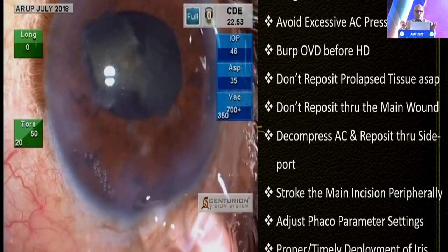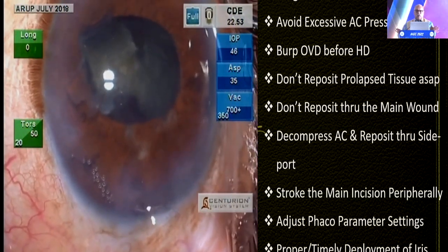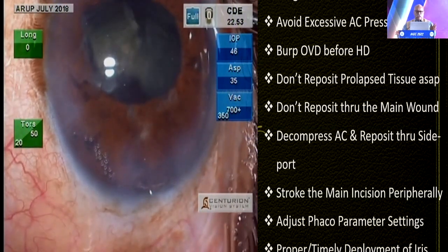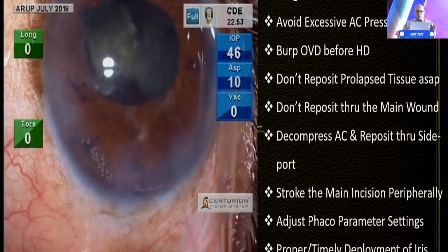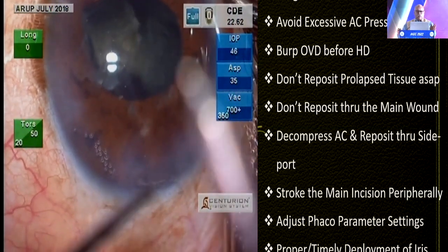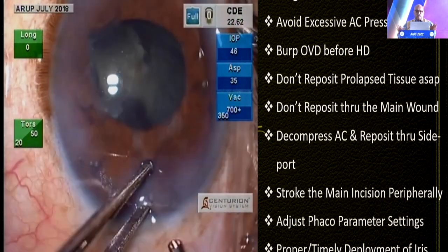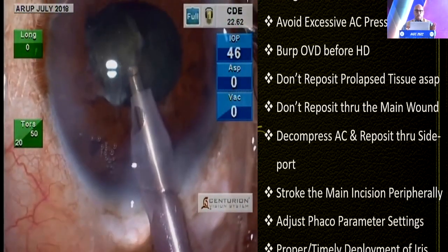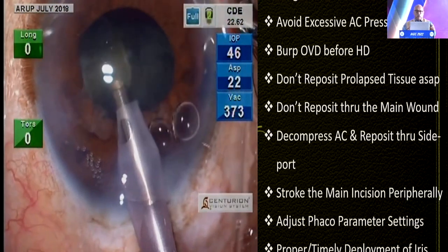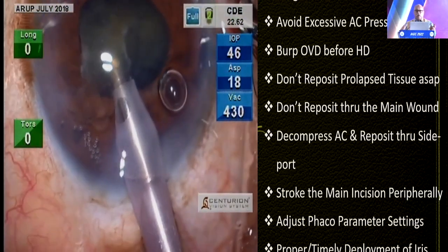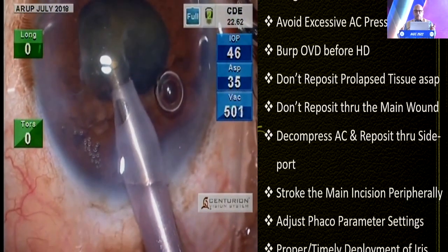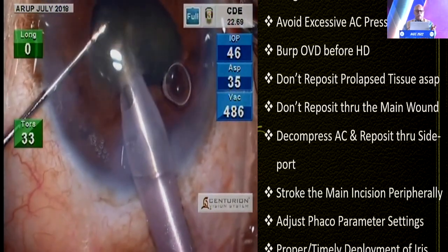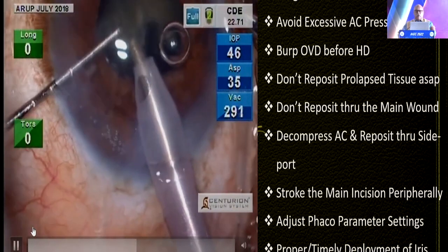A dispersive OVD is injected, ensuring the iris is pushed down, creating adequate space for the phaco handpiece to enter the anterior chamber. The bottle has been changed, and I fix the globe with my tooth forceps so there is no undue pressure on the eye, which would increase intraocular pressure and predispose to iris prolapse. Subsequently, nucleus management goes on well.